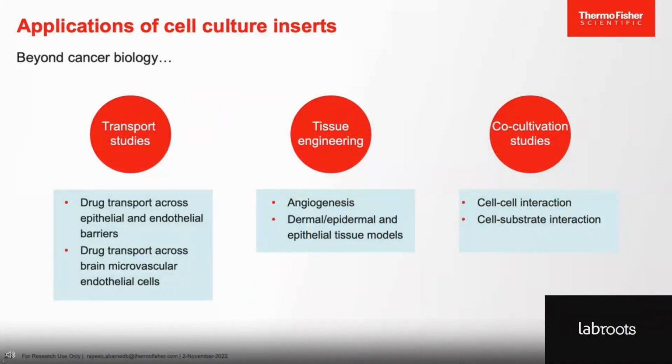Okay, so beyond the cancer biology applications, these cell culture insert systems can be used for a variety of applications, such as transport studies, mainly to name drug transport across epithelial and endothelial barriers, and to study drug transport across brain microvascular endothelial cells, such that we can even create a blood-brain barrier model using the cell culture inserts.